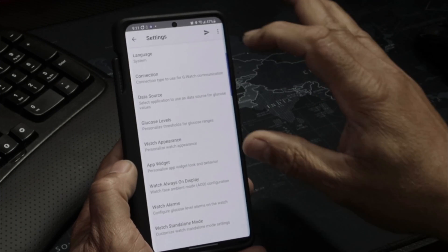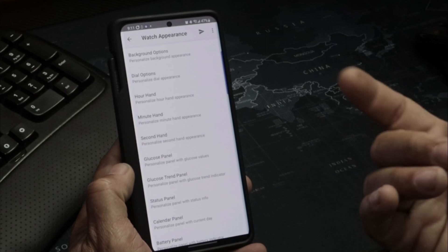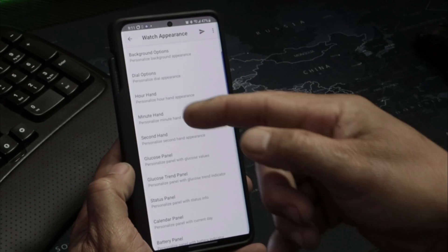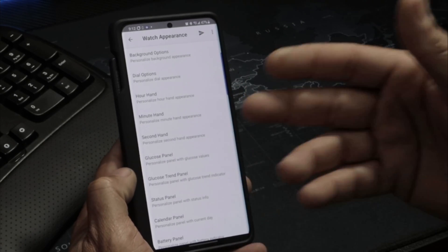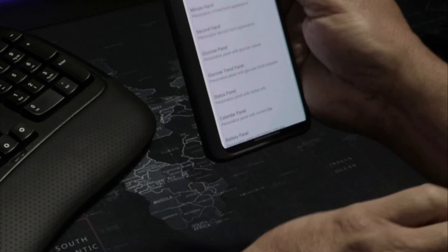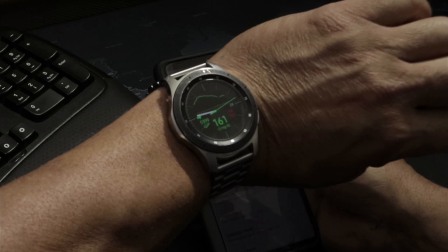To customize your watch face, go into Settings and then Watch Appearance. In here you can configure everything: your hour hand, minute hand, second hand, and your glucose panel — it's all there on the watch.